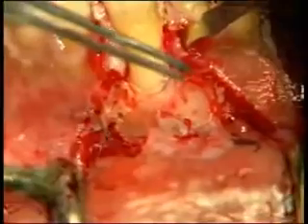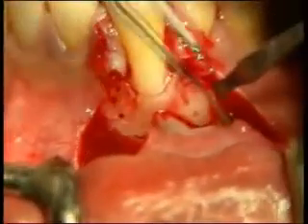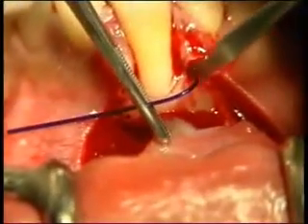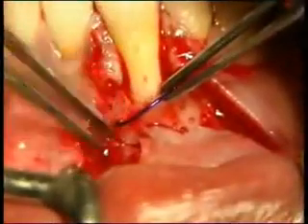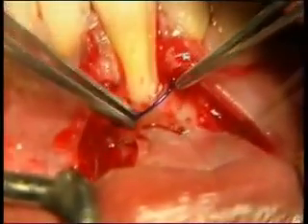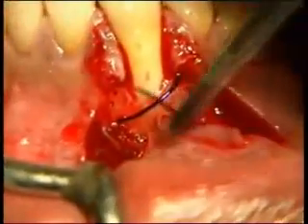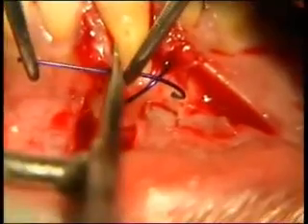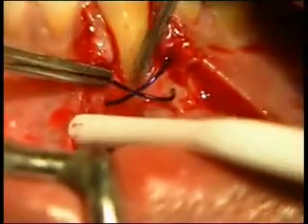With a very small tungsten carbide burr, the cortical is perforated with small holes to expose the underlying medullary cavity. At this point, two segments of the PDS-II suture are used to create a dome above the root surface. The extremities of the two PDS-II segments are shortened and inserted within the four holes to create the desired dome effect.